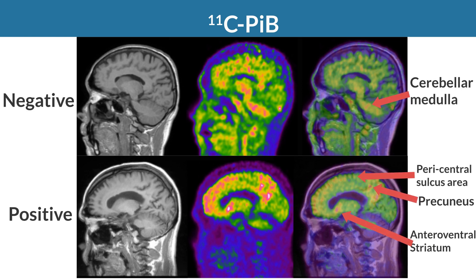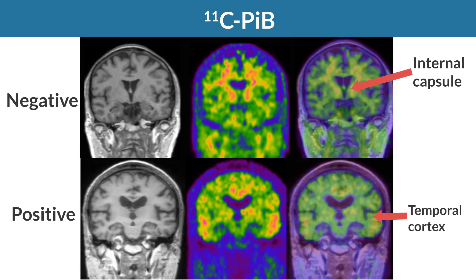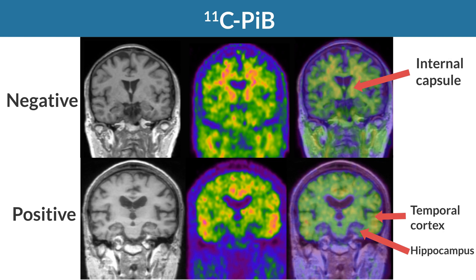Anteroventral striatum shows high accumulation in a positive case. In the coronal section, the hippocampus shows low accumulation in a positive case.